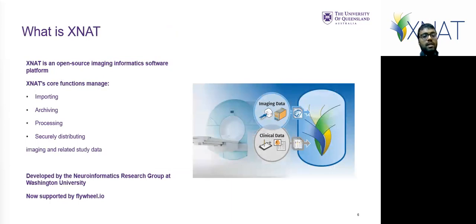So, general things about XNAT. XNAT's an open source imaging informatics software platform. Its core functions are to manage the importing, archiving, processing, and secure distribution of imaging and related study data. It was developed by a neuroinformatics research group at Washington University, and it's now supported by flywheel.io.